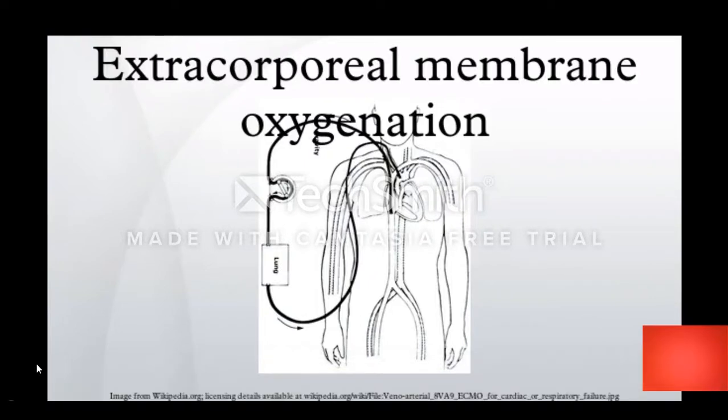Extracorporeal membrane oxygenation is an extracorporeal technique of providing both cardiac and respiratory support oxygen to patients whose heart and lungs are so severely diseased or damaged that they can no longer serve their function. Initial cannulation of a patient receiving ECMO is performed by a surgeon or anesthetist, and maintenance of the patient is the responsibility of the perfusionist or ECMO specialist, who gives 24/7 monitoring care for the duration of the ECMO treatment.